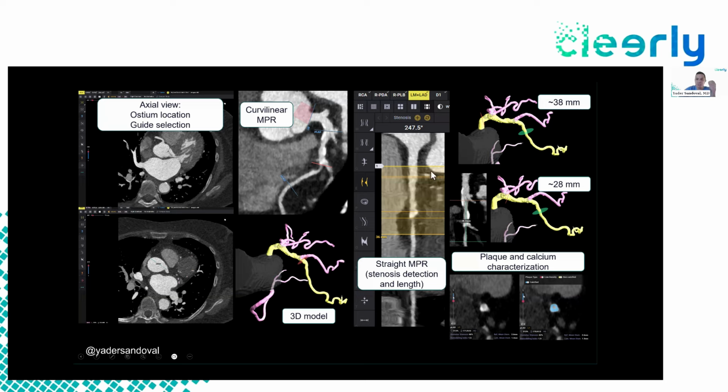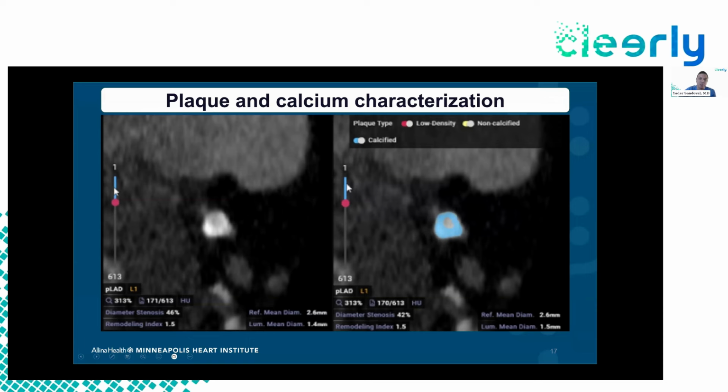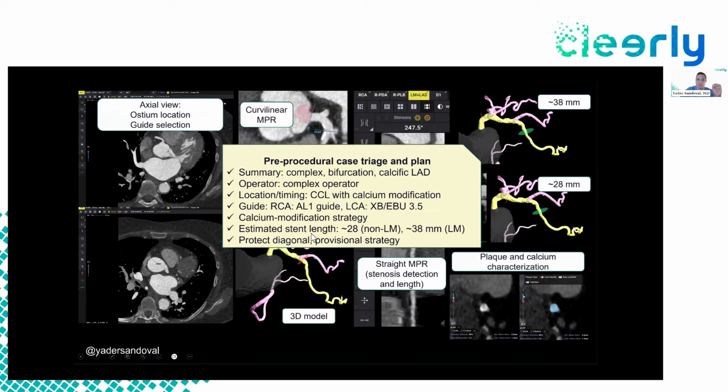And you can see here, same thing. You can get estimates based on plaque on healthy to healthy landing areas as to what stent you might potentially need. I really want to underscore that, at least from our perspective, the assessment of calcium is increasingly a very important aspect. And you can see here, non-invasively, clearly this is not for us in the cath lab like what we're often seeing on, let's say, OCT or IVUS, but the pattern of calcification can very easily be appreciated in a similar format on CT. And as you can see here, this is circumferential calcium. This needs to be treated differently.